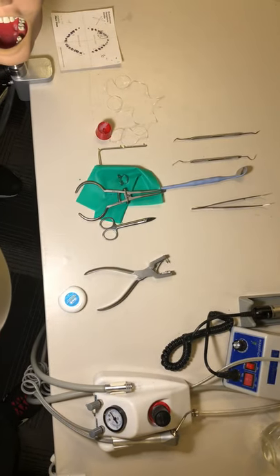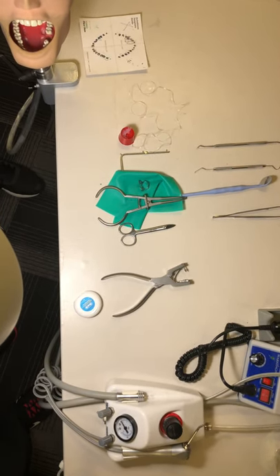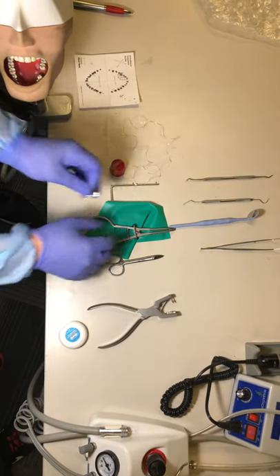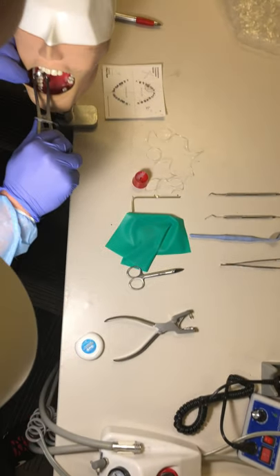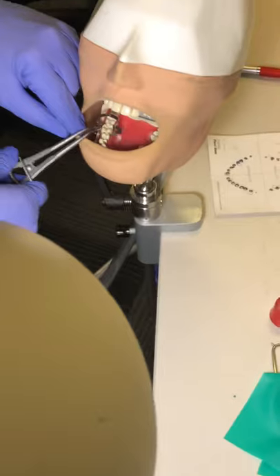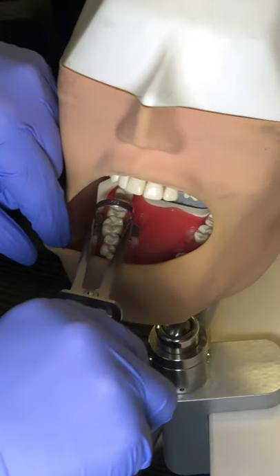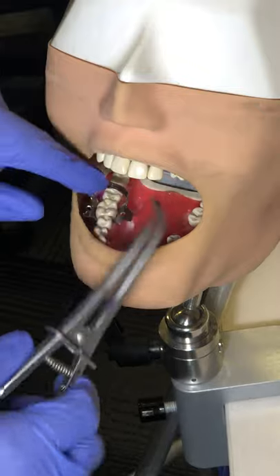We'll imagine now that we are in the dirty area with mirror, probe, and tweezer. We wash our hands again — or just sanitize to save time. We're now going to choose our clamps. We need to choose the best one that will attach to the tooth at four points — the peaks of the clamp should touch all surfaces of the tooth properly, giving four-point contact.